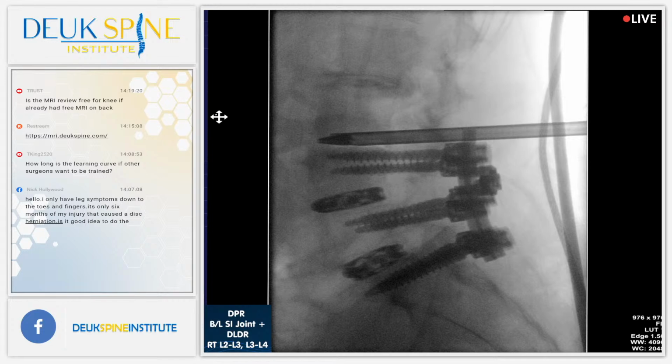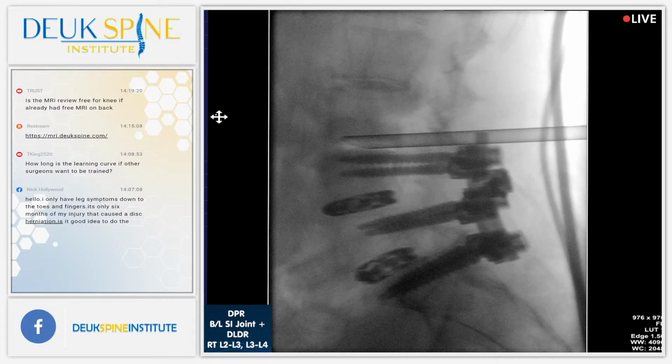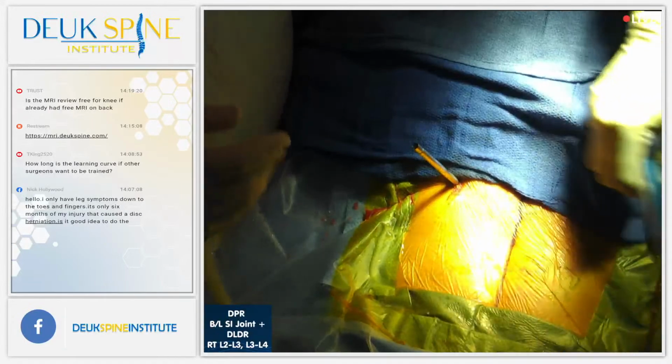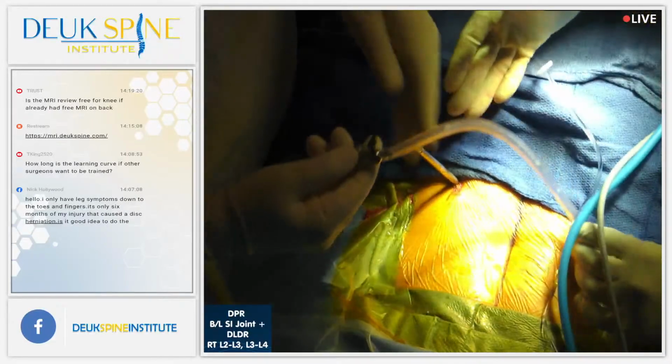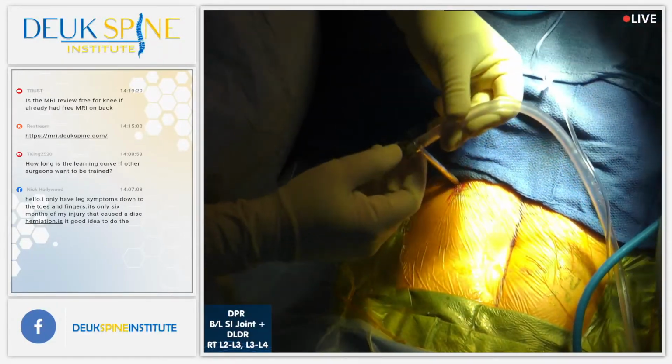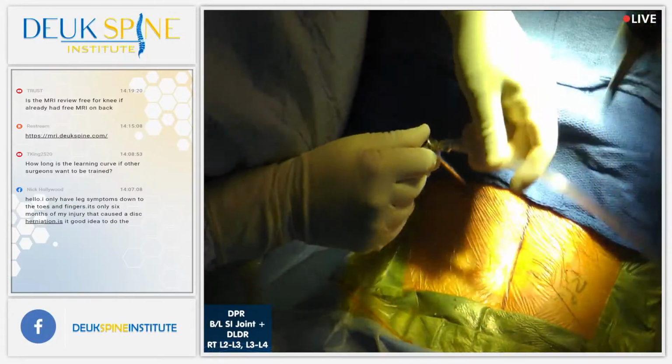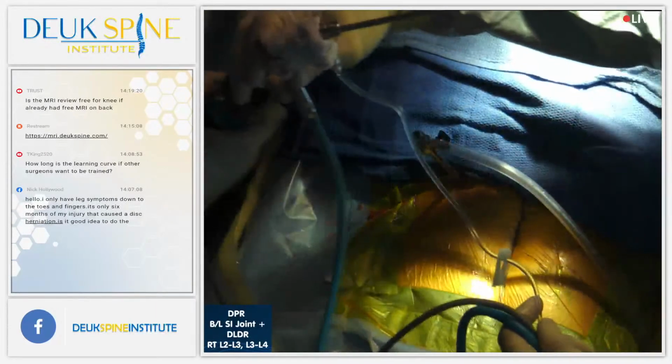Well, we were able to get into the disc, but it wasn't easy. It took some patience and perseverance and a little bit of strategy. We should be done in 10 minutes, Doctor. A lot of arthritis.